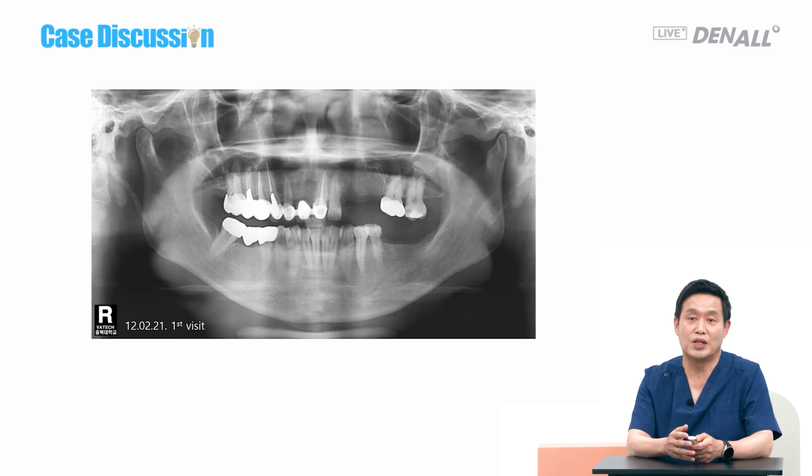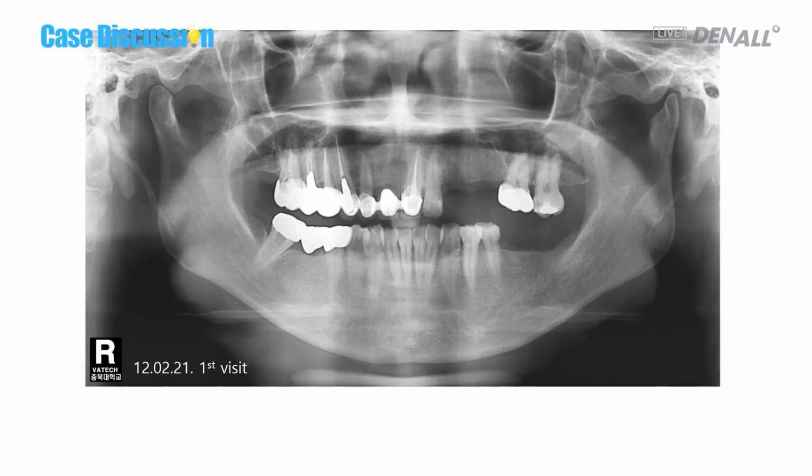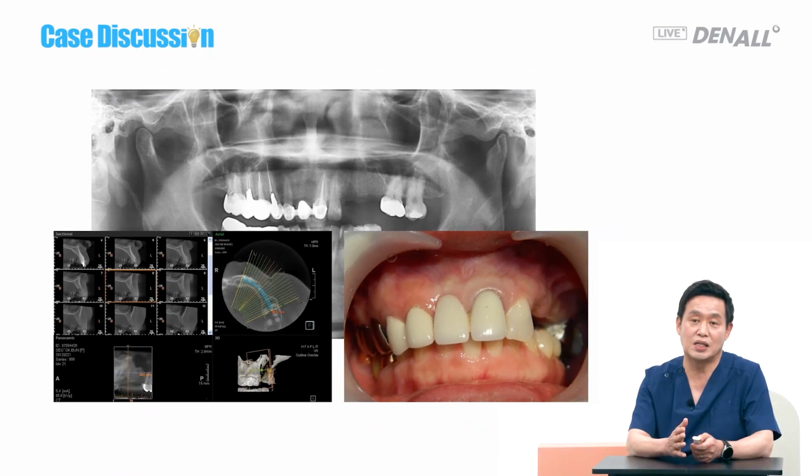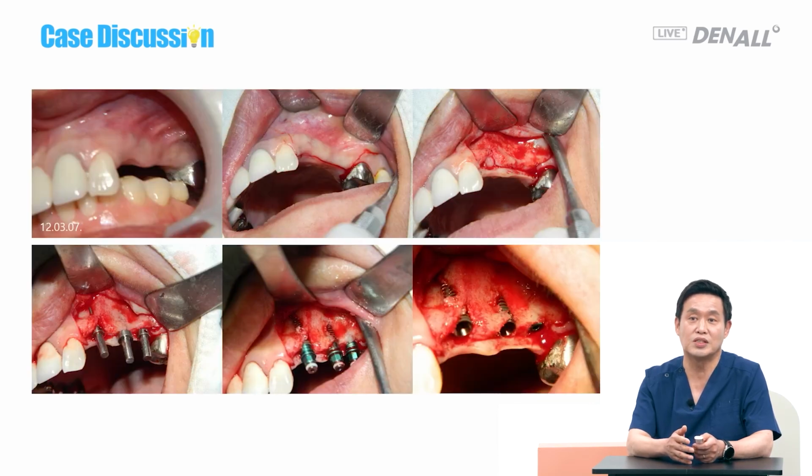The patient came to me for the first time in 2012. The patient was referred to me. In quadrant 2, the premolars are missing and the canine as well. The ridge is very narrowed clinically. On the cone beam CT as well, the ridge is very narrow and is collapsed. The width of the residual bone is not good. If you place an implant there, the occlusion with the antagonist tooth will be a problem. Based on the remaining teeth, the tooth axis will be distorted.